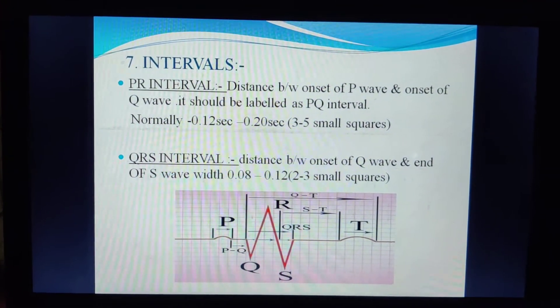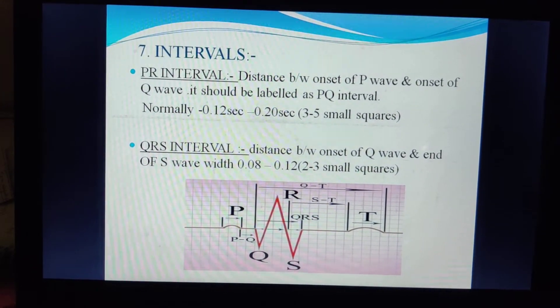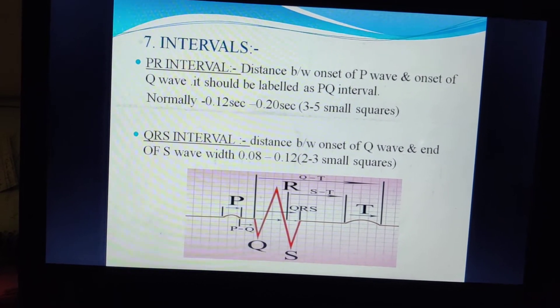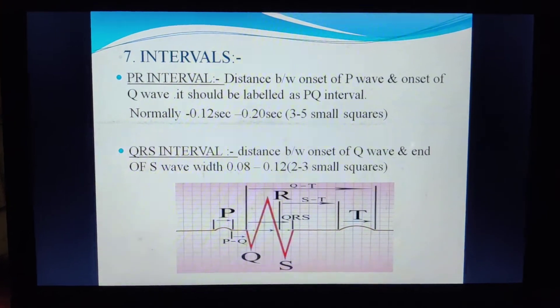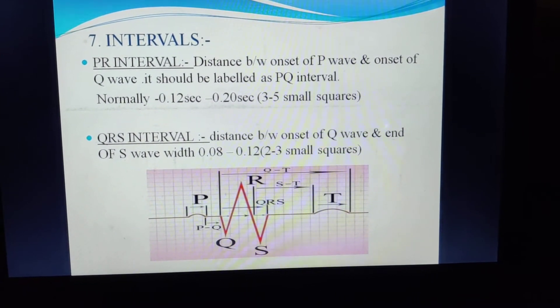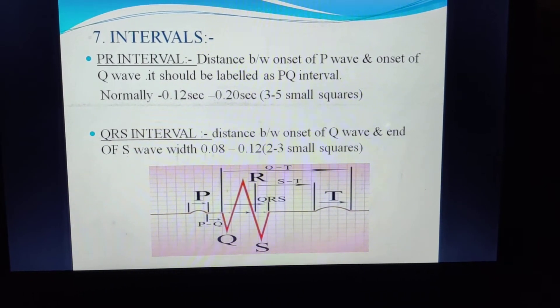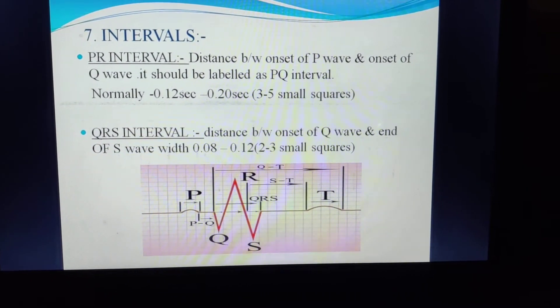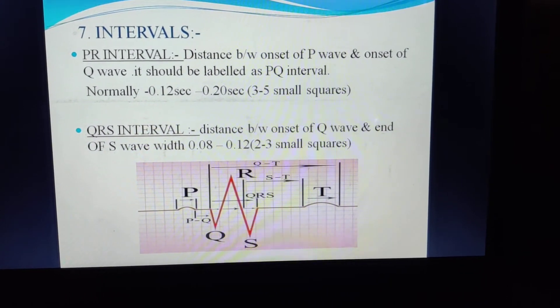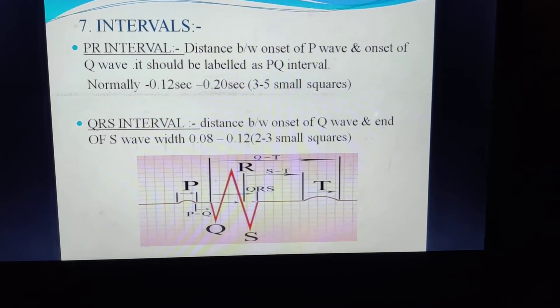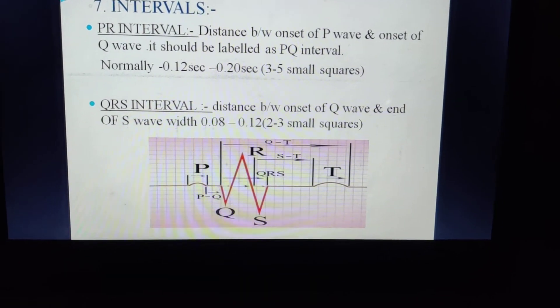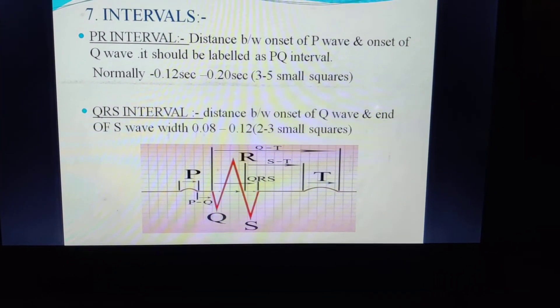Now the intervals. The PR interval is the distance between the onset of the P wave and the onset of the Q wave — though technically it should be called the PQ interval, it is known as the PR interval. Normal time is 0.12 to 0.20 seconds, covering 3 to 5 small squares. The QRS interval is the distance between the onset of the Q wave and the end of the S wave. Normally it covers 2 to 3 small squares and takes 0.08 to 0.12 seconds.